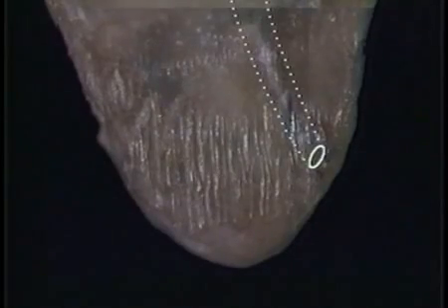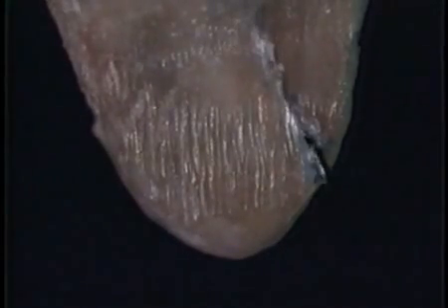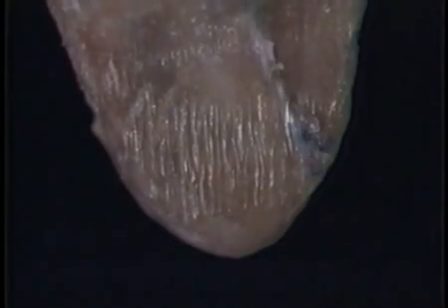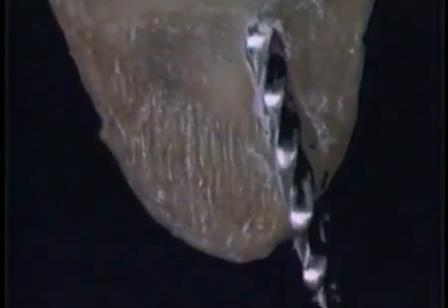Apical transportation is moving the foramen to a new iatrogenic position. As stiffer files are taken to length, the foramen is zipped and the apical zone of the canal begins to exhibit reversed apical architecture. Canals that don't have a continuous taper over length, or at least deep shape in the apical 5 mm, provide no resistance form for controlled hydraulics, and packing in 3 dimensions is fantasy.